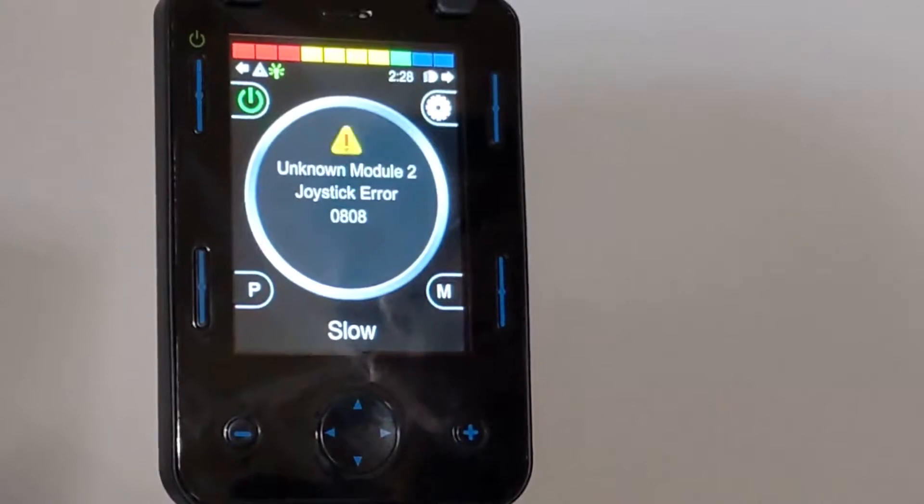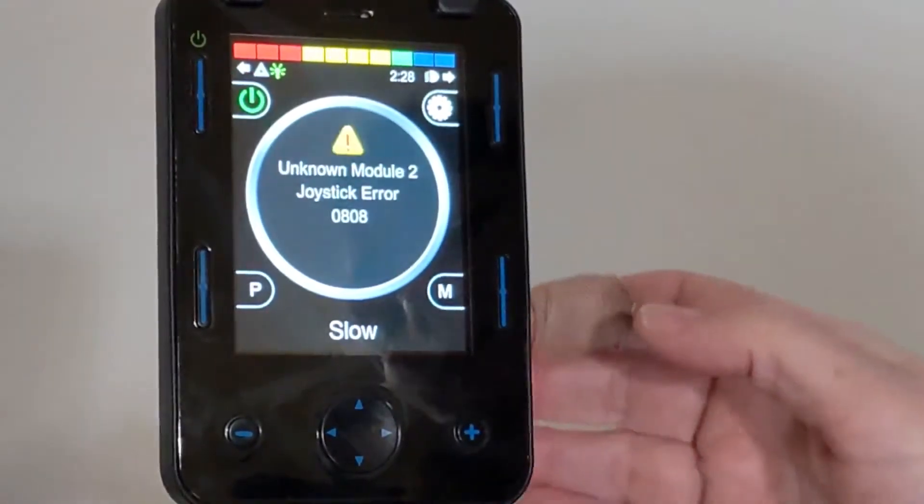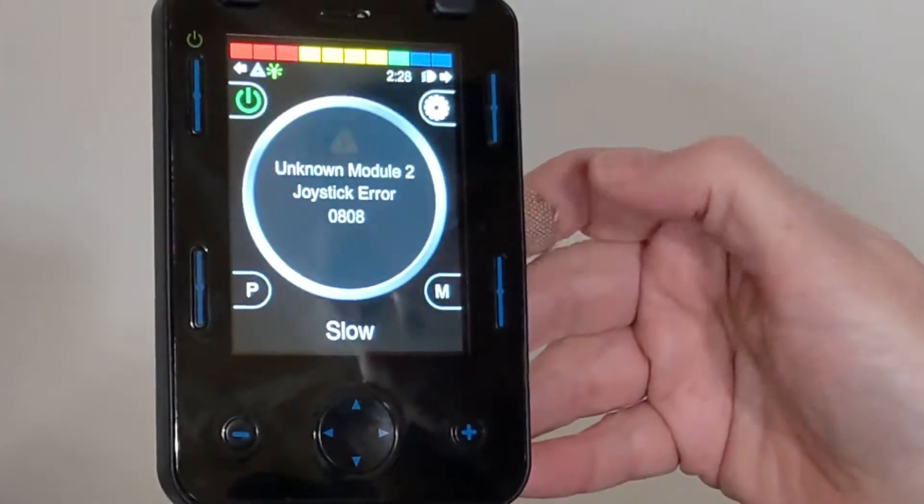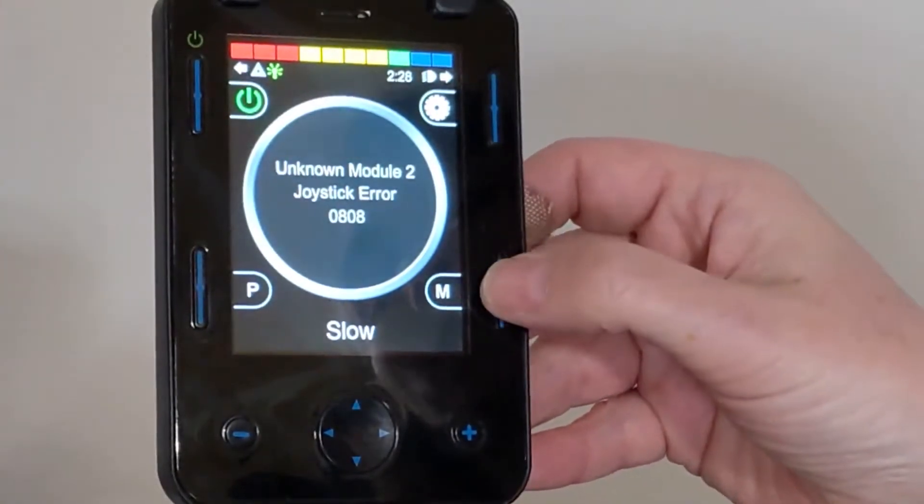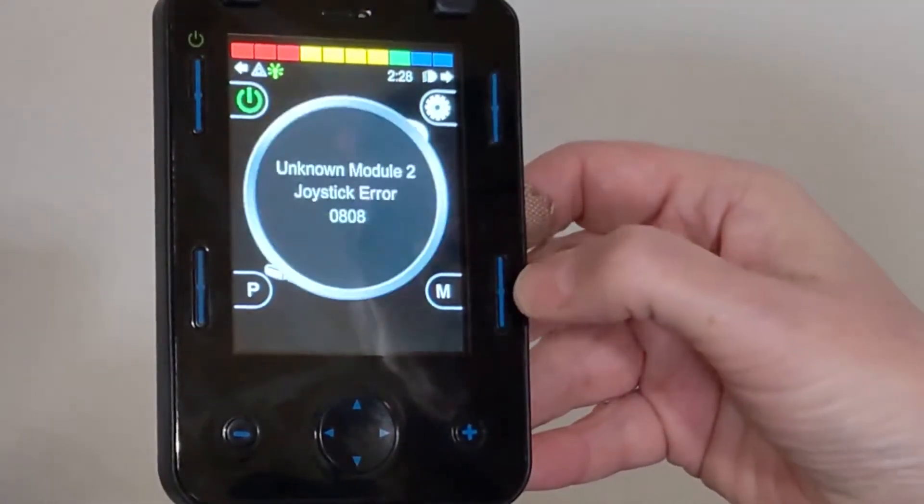When we first start out, you might see the 0808 error, and that just means things aren't configured correctly yet. So go ahead into your programming menu.